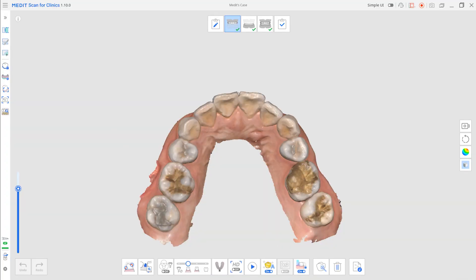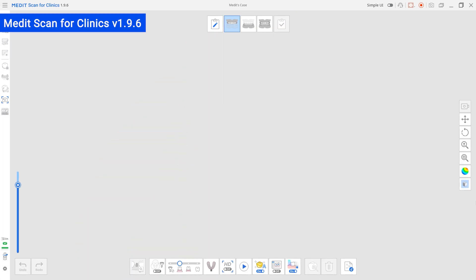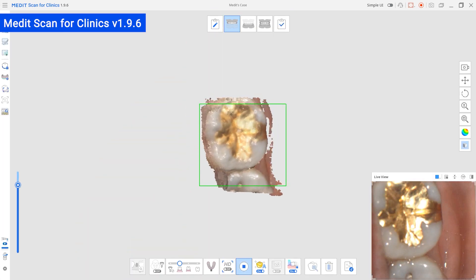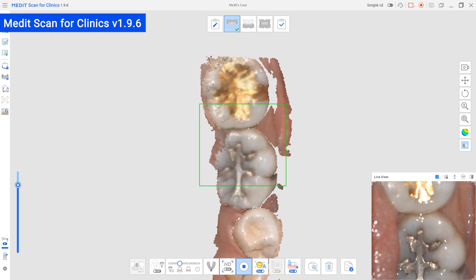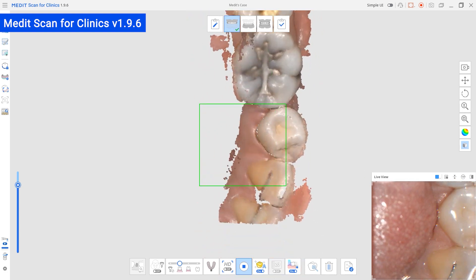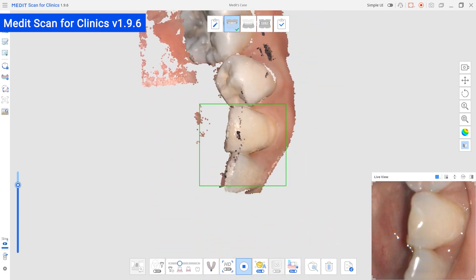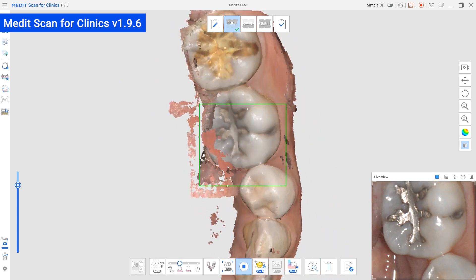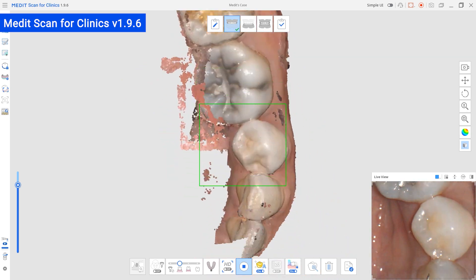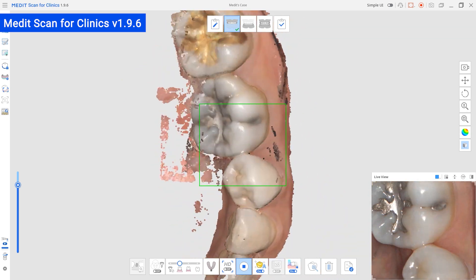Next, a new AI engine has been added. It removes unnecessary soft tissue data quickly and accurately by adding an AI engine equipped with the latest technology, having more precise learning data.